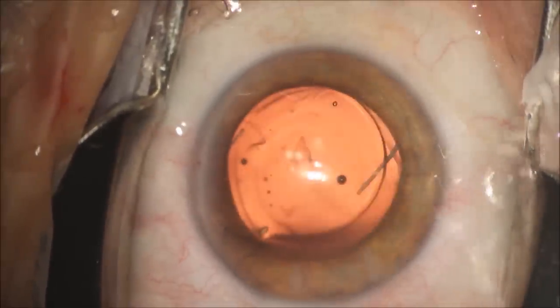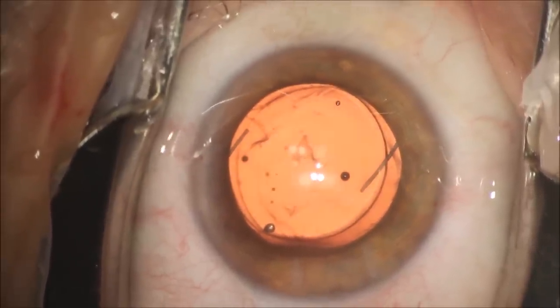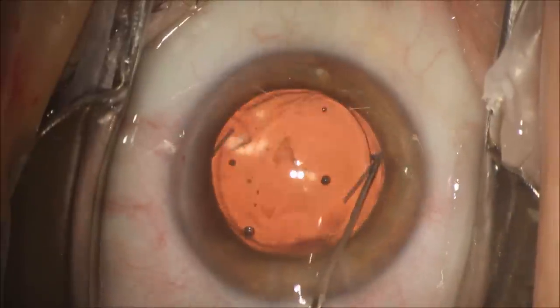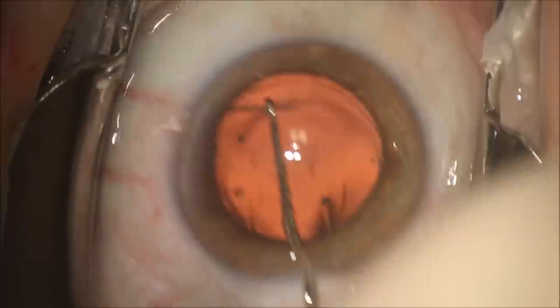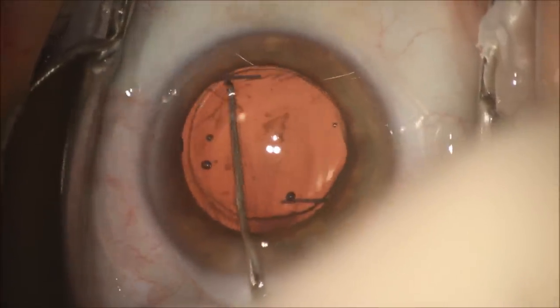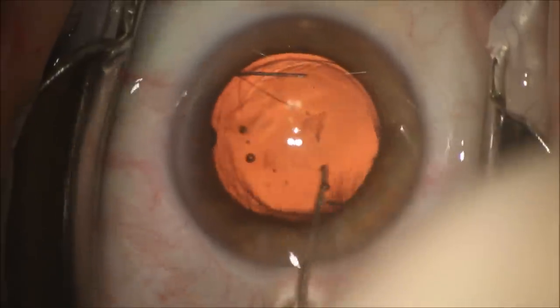And once the lens sits in the capsular bag, we will make sure we can rotate that lens freely inside the capsular bag, breaking any further adhesions and letting the lens sit in its proper orientation. The LI61AO lens is angulated 10 degrees backwards, and it should sit firmly against the posterior capsule.